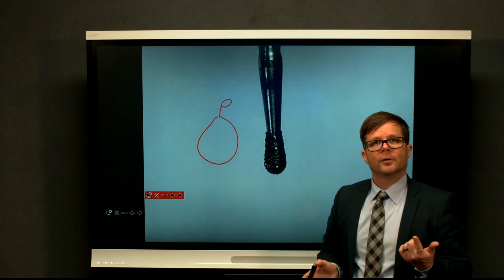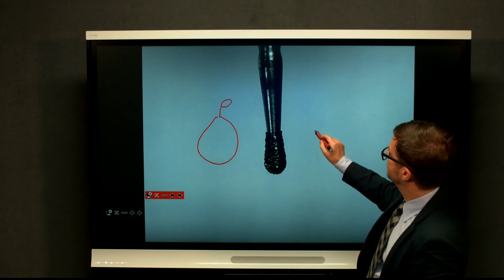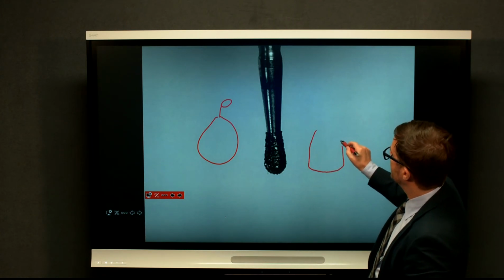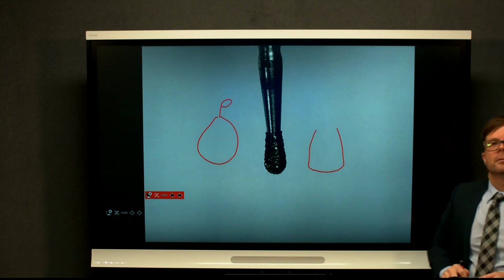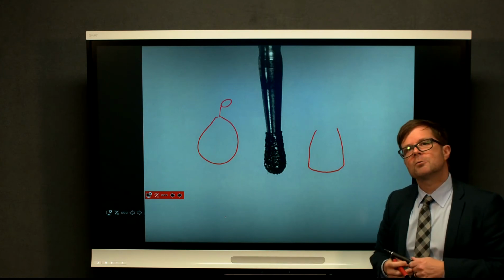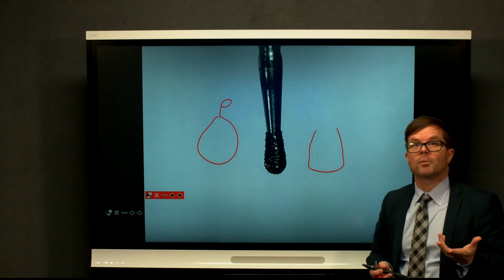Unpause. You've probably decided now that this is the shape that would result from using the pear-shaped burr in that manner. And, quelle surprise, what have we actually got here? We've got the characteristics of the ideal minimal cavity preparation.